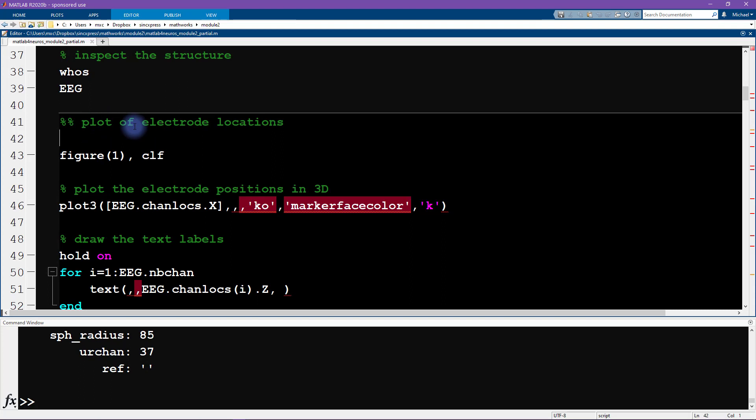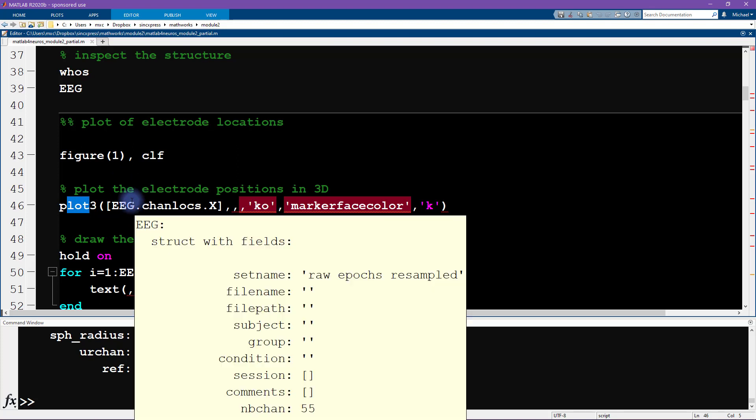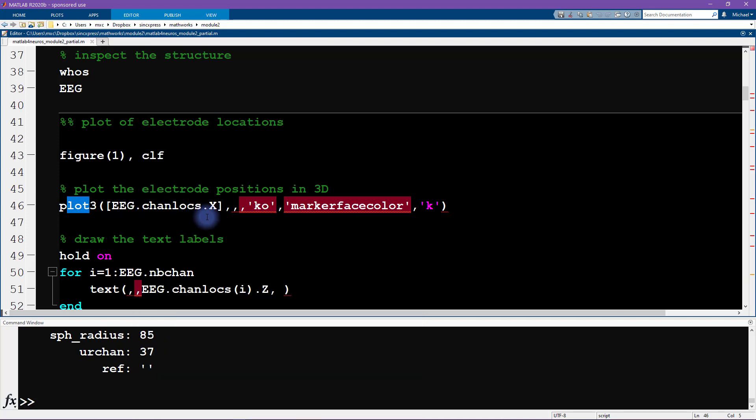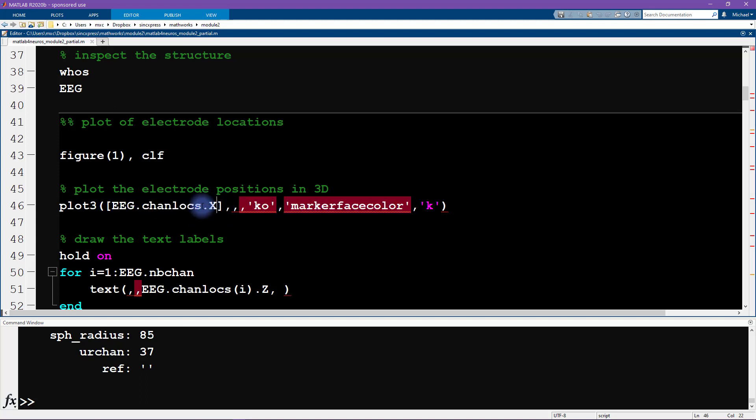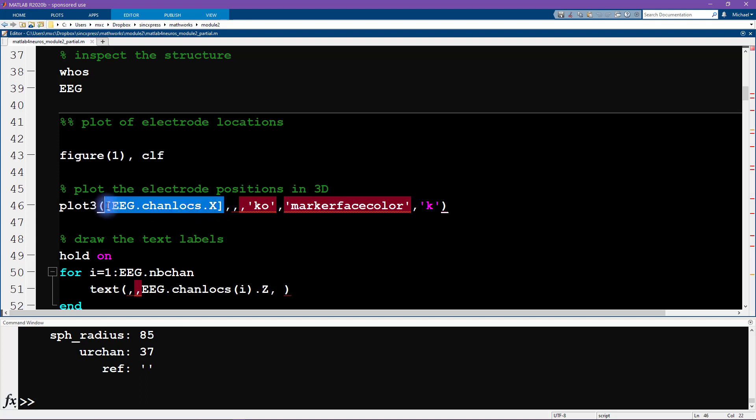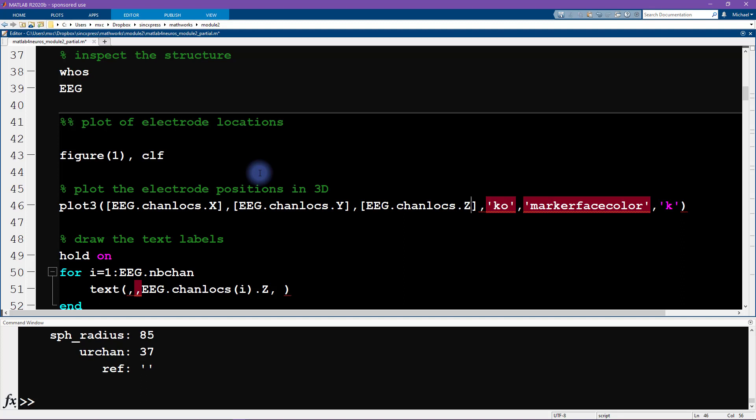We're going to plot the electrode locations first in 3D. So we are going to use the function plot3. We need to input three different inputs corresponding to the x location, the y axis location and the z axis location. It's pretty straightforward what to do here. First of all, we concatenate all of the results from all the channels. We use square brackets to concatenate them into one vector. This is for x, then we do it again for y, and then again for z.